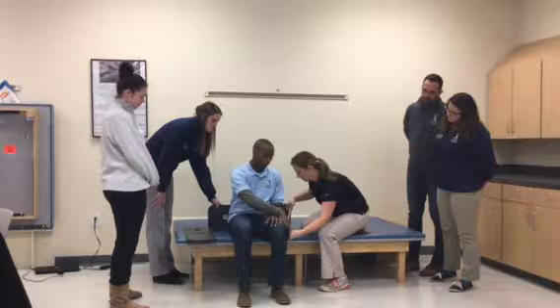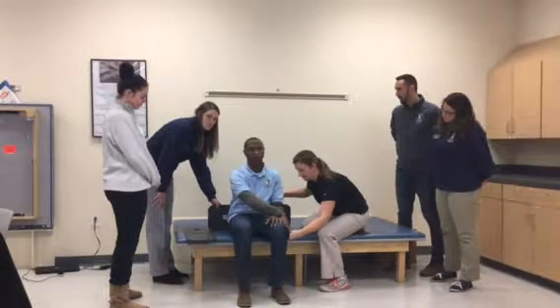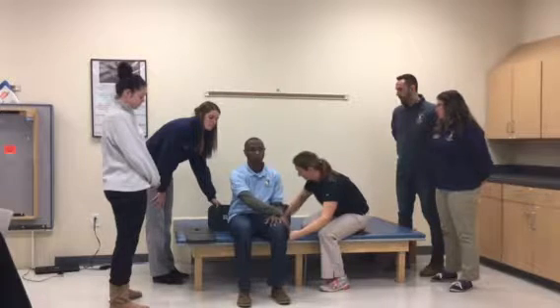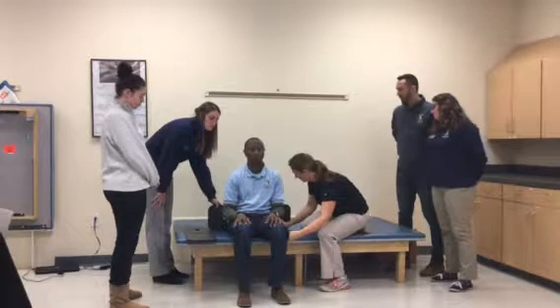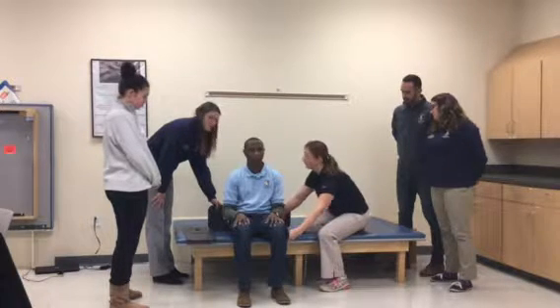Typically we take either a pen or some type of instrument to put behind the crease of the knee so that you have a stable surface to measure, so you're not changing the angle of your measurement and skewing the results. 24 inches.